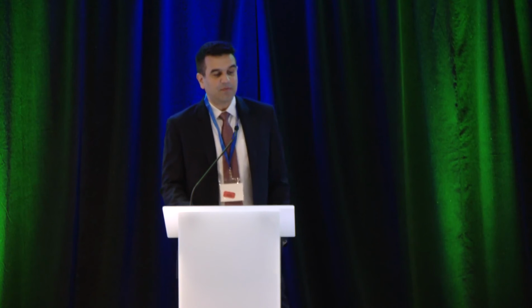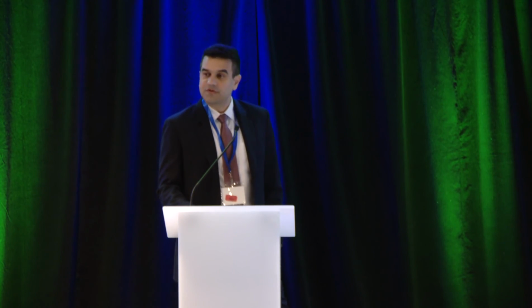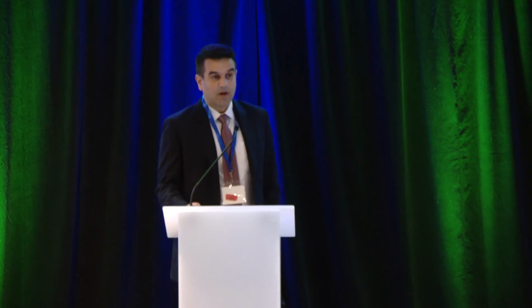What we're going to go through today is some of the updates from 3.0, which you've heard about already. A lot of what we'll be talking about is conclusive disorders versus inconclusive patterns, with an emphasis that specific motility disorders should be considered clinically relevant only in the context of specific symptoms or supportive testing. And I encourage all of you, especially those new to this, to read some of these technical reviews that have come out this year associated with the Chicago 4.0 classification.